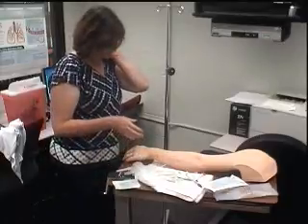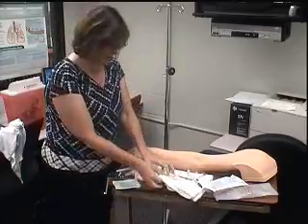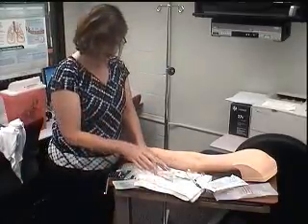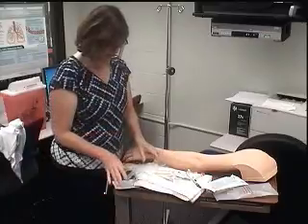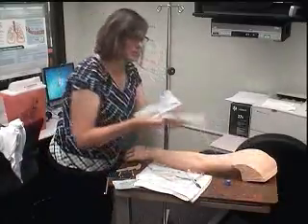All right, so then I want to gather my equipment, wash my hands. So what kind of equipment do you think I need? I'll probably need something to protect the bed, a towel or a Chuck's pad, something like that. I'm going to definitely want gloves. I need my fluids that I pulled out already.